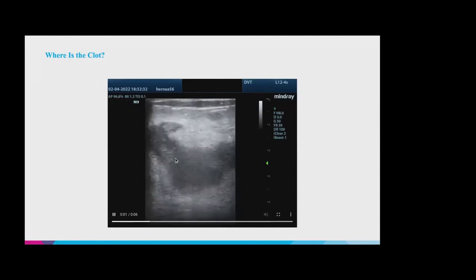Yeah, and it's a little grainy right now, but you can kind of see there's something bright in the whole saphenous and even up towards some other further branch points. So I think this is a pretty extensive DVT, but definitely the fact that it's not compressible would make me worried for a clot. And I think the saphenous vein looks a little bit more dilated than what I would expect as well, to suggest that maybe there's some blockage of flow. So yeah, this is definitely a large left common femoral DVT.